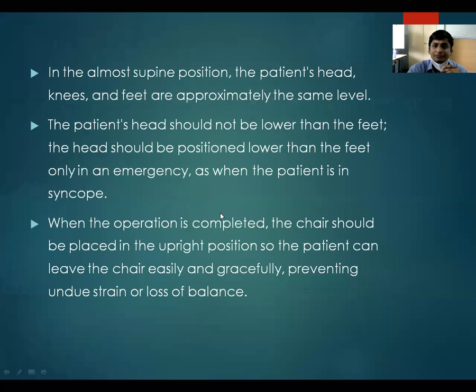Only in case of syncope, a medical emergency, should the head be positioned lower than the feet. When you lower the patient's head in such an emergency, we are supposed to keep the patient's head below the level of the legs. In all other procedures, the patient's head should not be lower than the feet. When the operation is completed, the chair should be placed in the upright position so that the patient can leave the chair easily and gracefully.